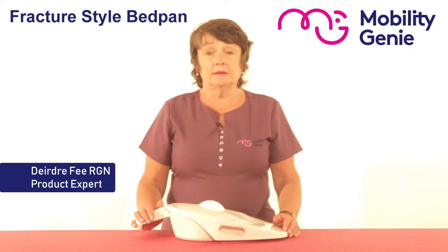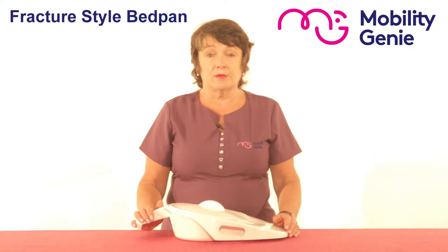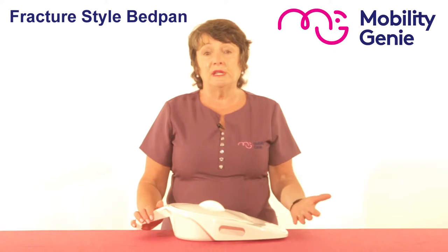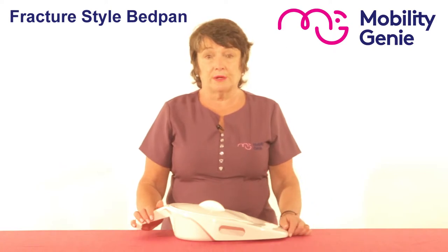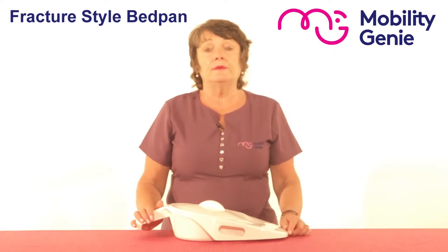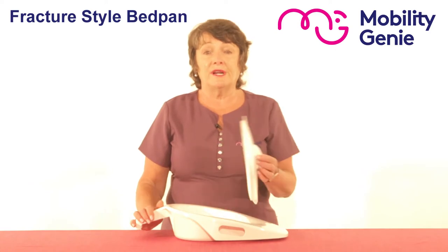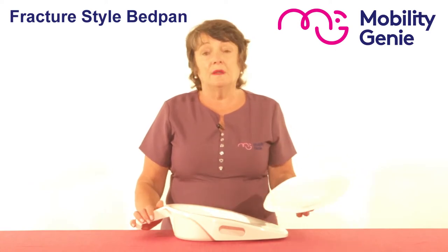Deirdre from Mobility Genie here. Many of our customers are carers looking after somebody in the bed, maybe confined to bed or moving between a bed and a wheelchair or an armchair. Often they would need to go to number one or number two, so toileting support is essential.